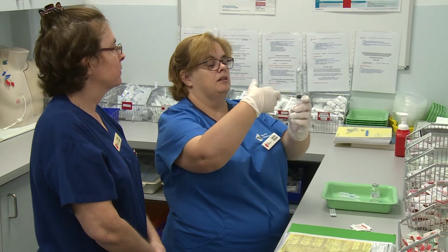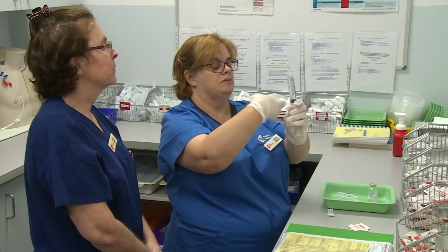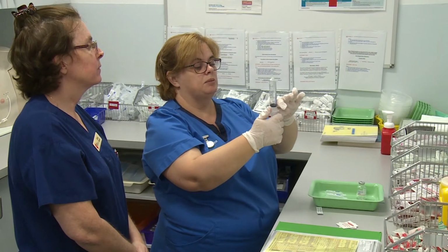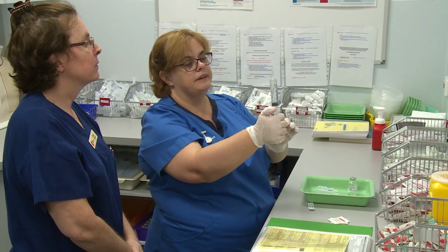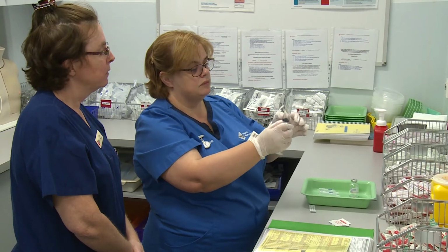And then I'm going to get rid of my bubbles. So you just need to tap it hard to get rid of those bubbles. Okay. And now just make sure we have 20 mils. Okay, 20 mils. Great.